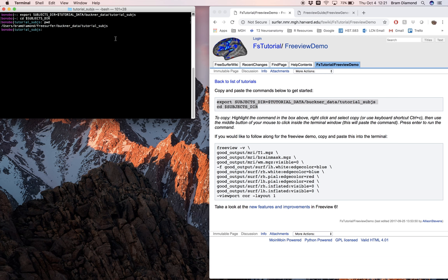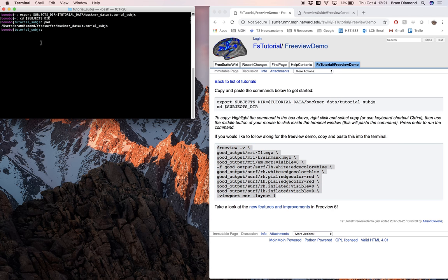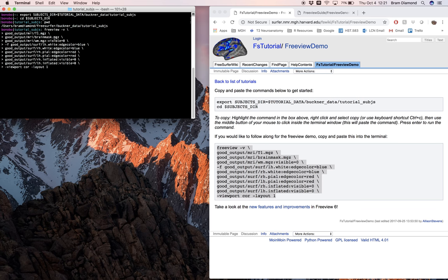Next, copy the FreeView command with all the arguments and parameters. The FreeView command does quite a few things. The first part, 'freeview,' will just open the FreeView GUI — without any following parameters, it would just open a blank GUI. We've included the -v flag, which indicates that the following files will be volumes: the T1, the brain mask, and the white matter MGZ.